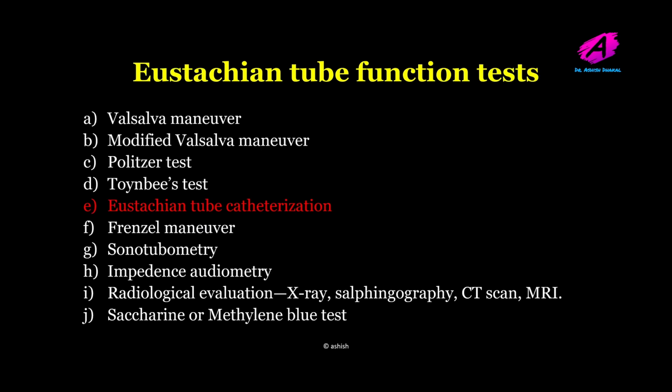The other Eustachian tube function test is Eustachian tube catheterization. This test was commonly used previously, but nowadays it is not so much used, as it is a minimally invasive procedure and can cause some complications.